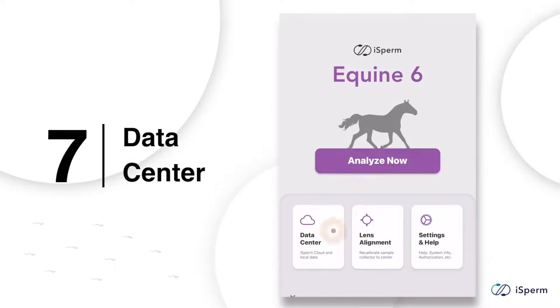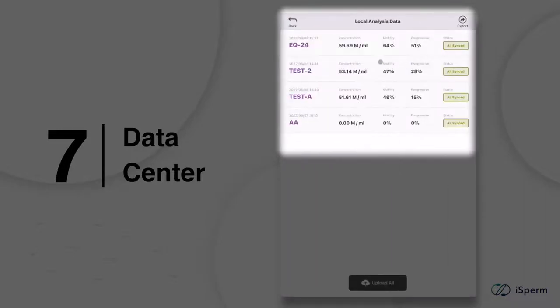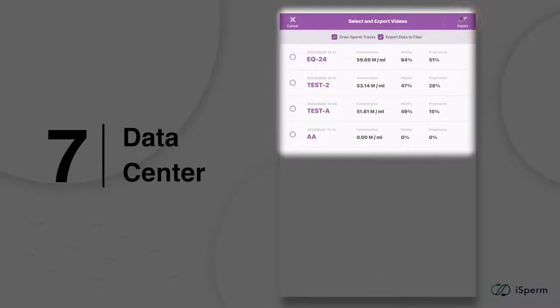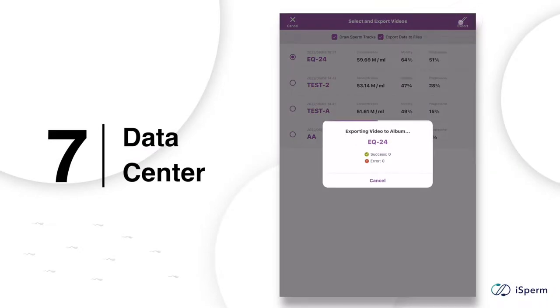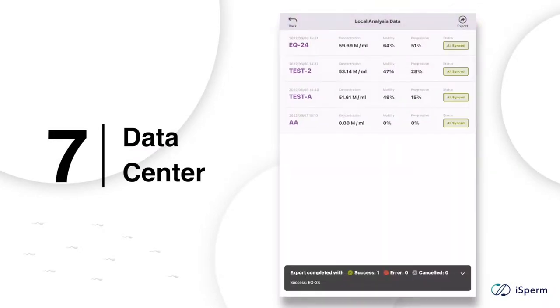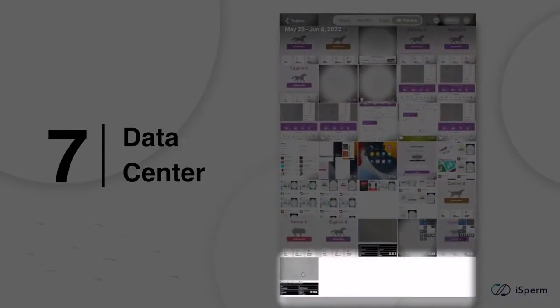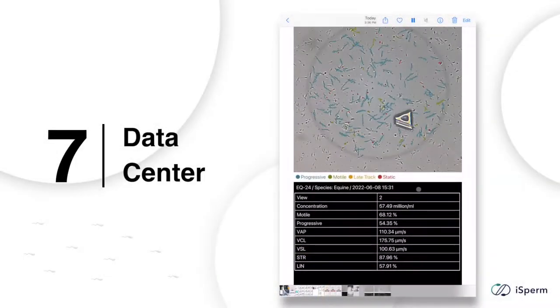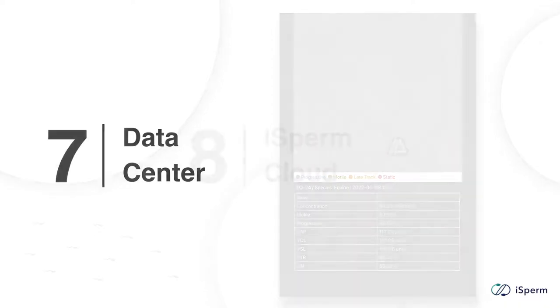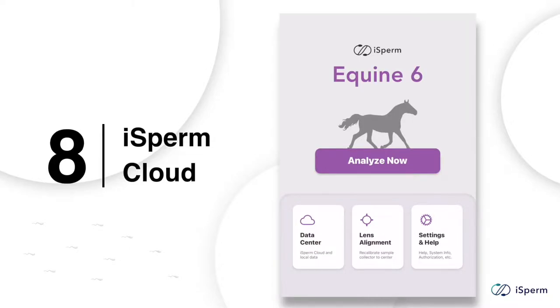To find saved data sets, go to Data Center on the home page, tap 'Local Experiments,' and scroll to locate the one you'd like to review. You can export data, and all data is automatically uploaded to your iSperm cloud account — an online storage space offered to iSperm users for free whenever your device is connected to the internet.